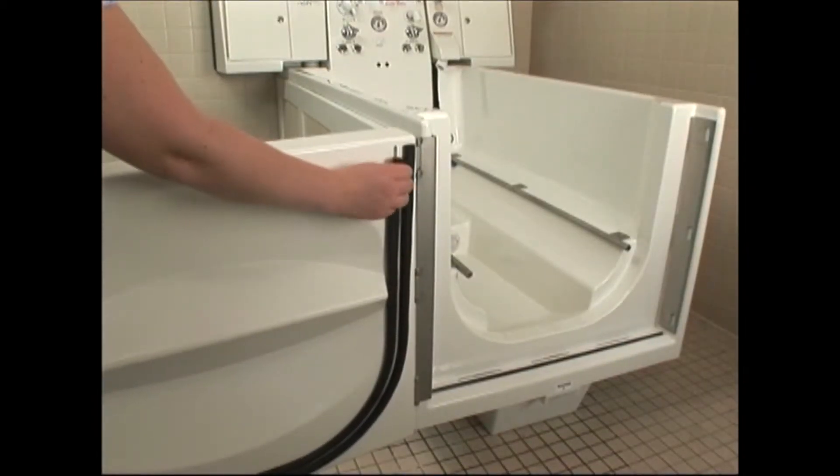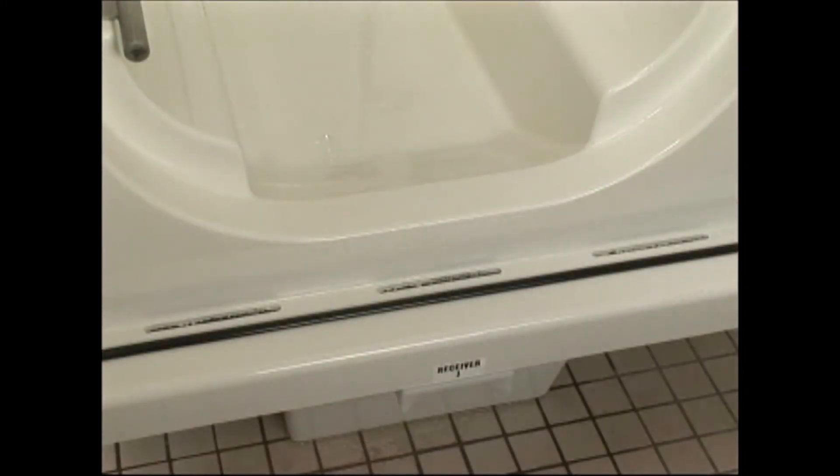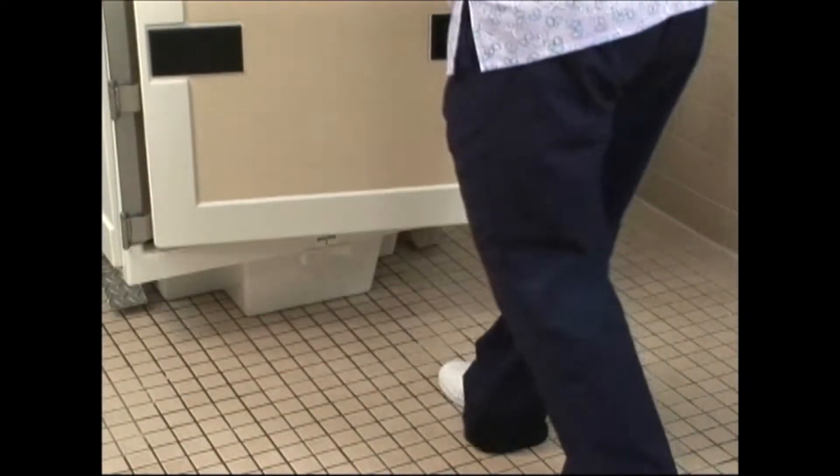To prevent leaks, the Advantage door is equipped with an easy-to-replace double gasket and a residual drain system that channels any water seepage out through the tub drain.